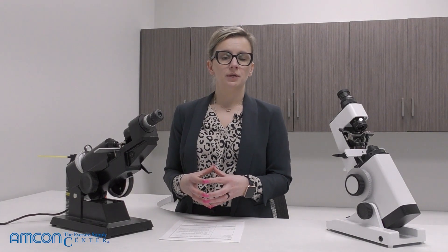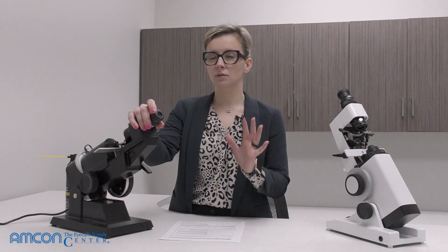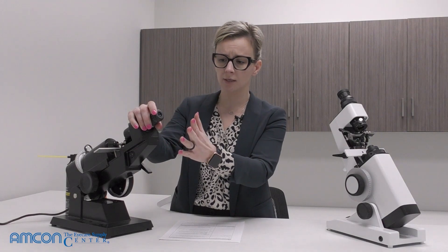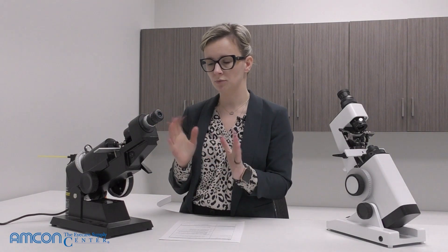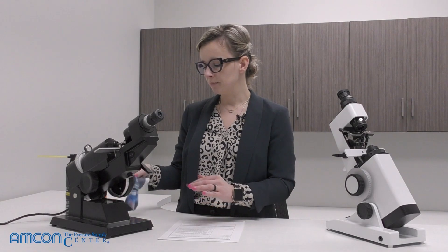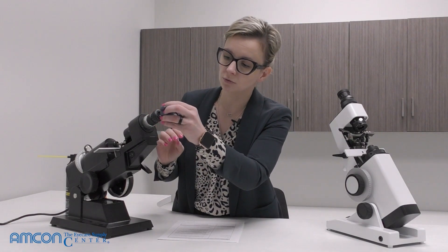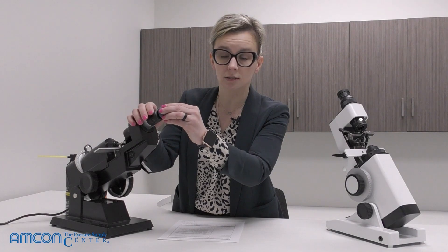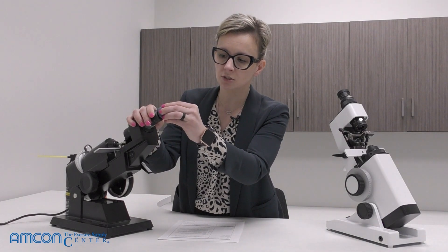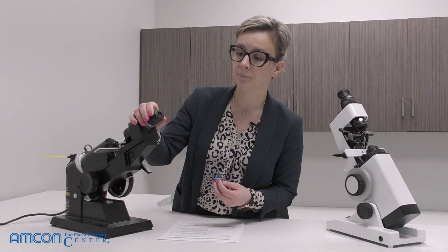Another thing you want to make sure is clean on your lensometer is your eyepiece. Sometimes if you get a little too excited and lean too close, you can touch your actual eye to the eyepiece — it does not feel good. Even just standing and talking, you might get fingerprints on there. Take a microfiber cloth, set it on the eyepiece lens, and rub in a circular motion for about 10 seconds to wipe away any grease or oils.